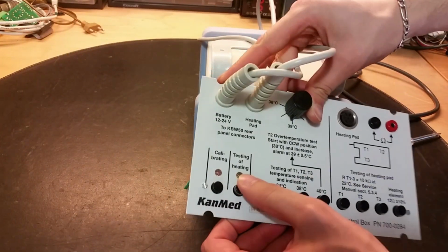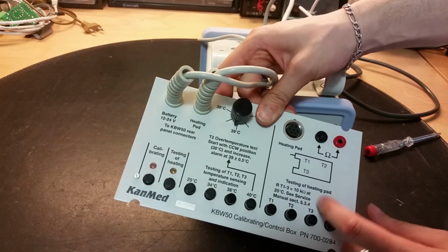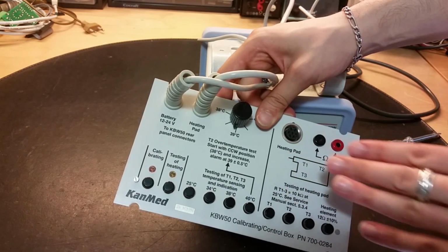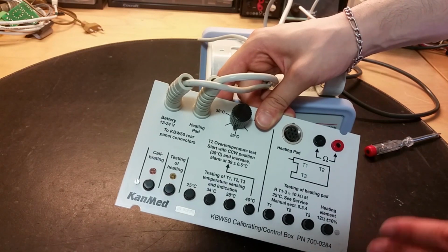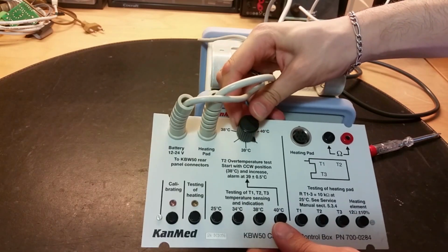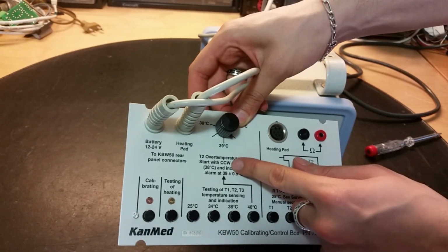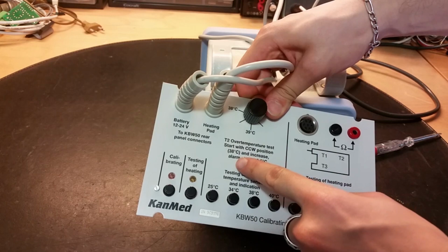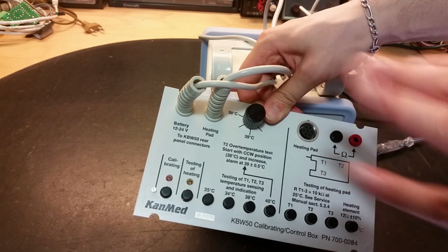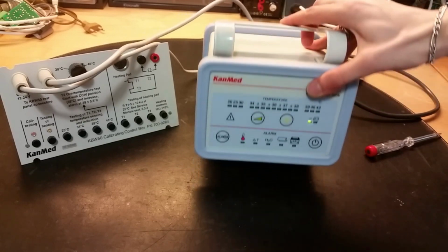Yes, we got on this test panel, we got testing of heating and calibrating. And yes, we got this heating pad. It looks like that, kind of. We put the baby on the heating pad because babies cannot regulate body heat so well. And we got this little knob here that can fine tune the heating. Actually 40 degrees, that goes up here. And we can also do an over temperature test. So you don't want to cook the baby, you want just to warm it up a bit. So yes, let's take it apart and see how it works.